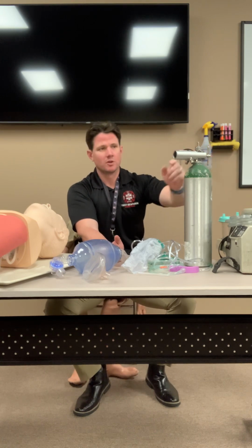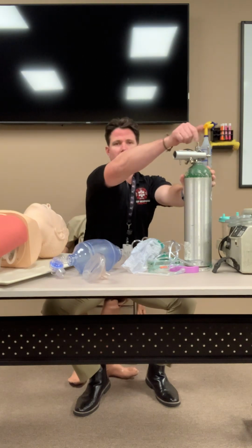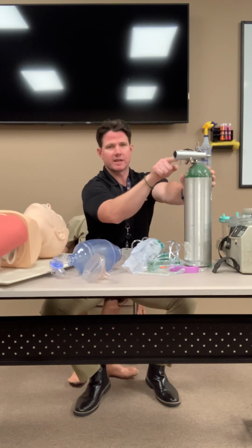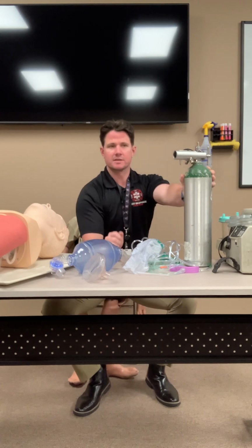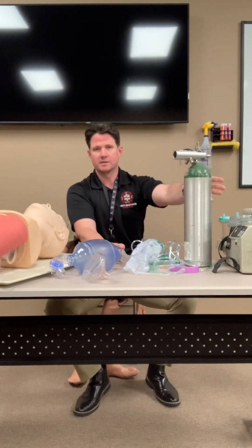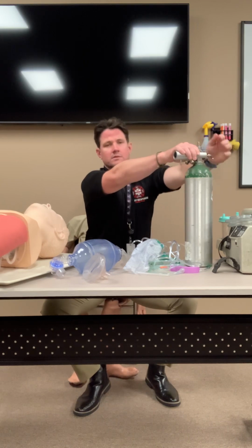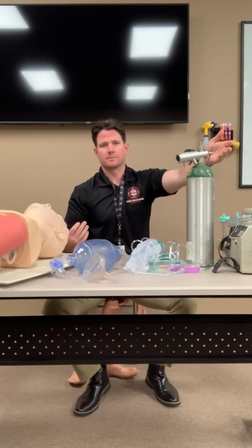So this is very simple. With the flow meter still blowing out oxygen, take your oxygen key, close off the bottle. Once this is completely closed, this is still gonna relieve the pressure that's within the regulator. And once this stops, you stop hearing air come out of this, that means the whole system is depressurized. And all you gotta do now is take your regulator off, okay?